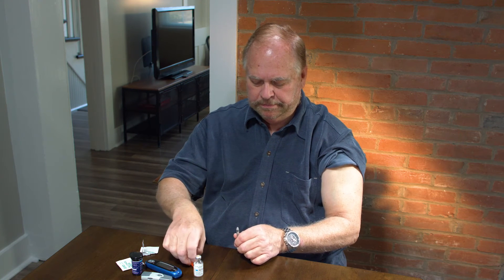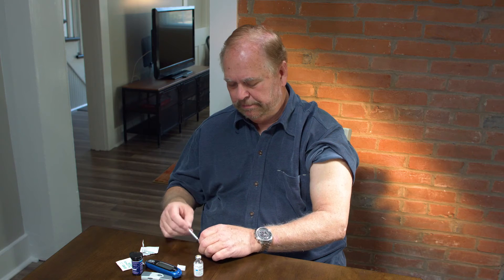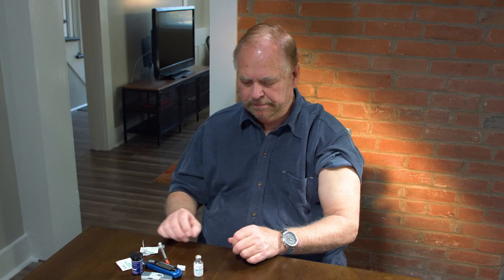Replace the protective cover on the needle and dispose in the trash. You will never reuse the syringe, so be sure to dispose of it safely.